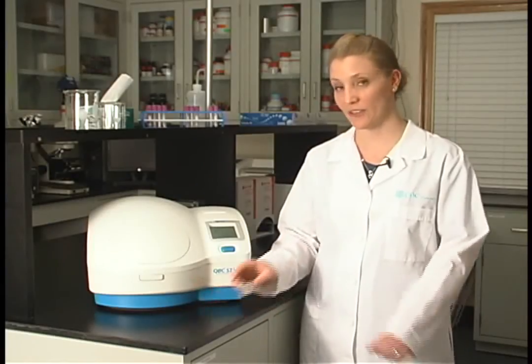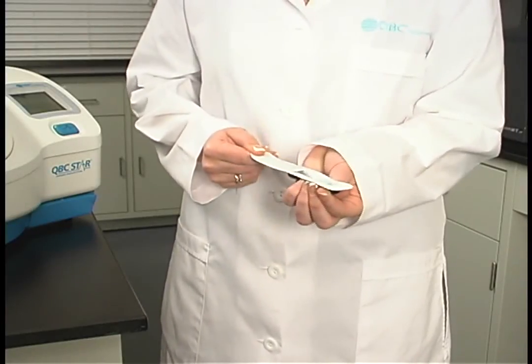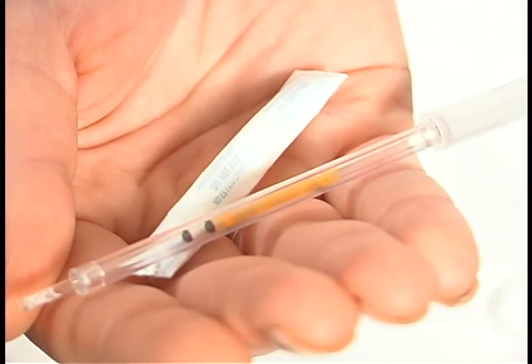It's important to carefully open the STAR tube. Peel back from the red arrow to the end of the package and drop the package contents into your hand. Inside the package, you will find a STAR tube, as well as a desiccant packet, which may be disposed of.